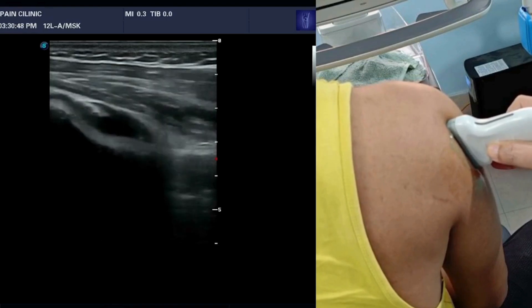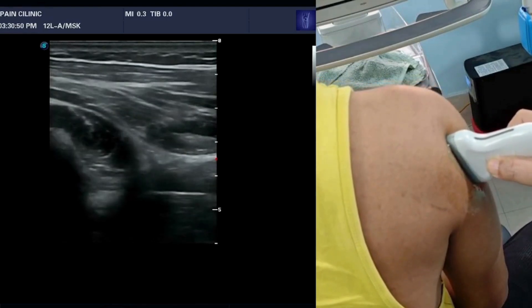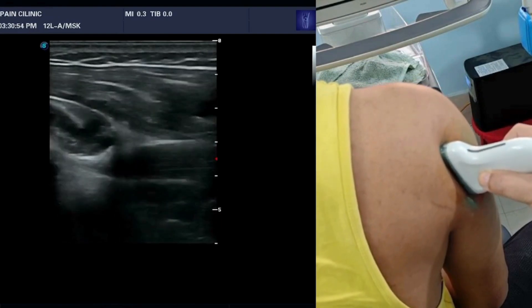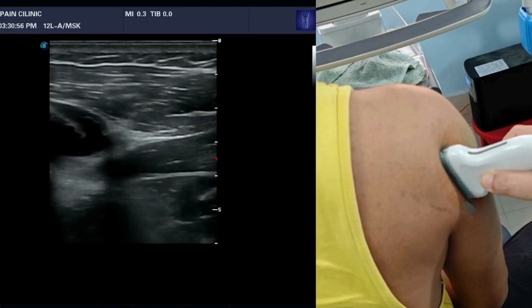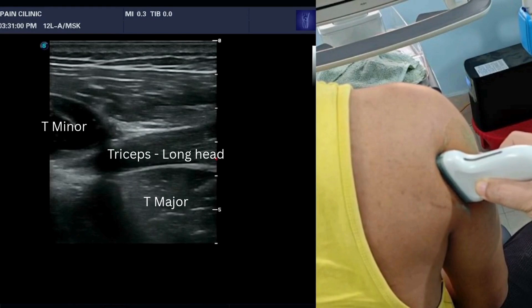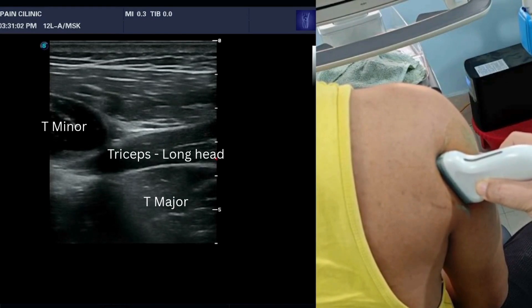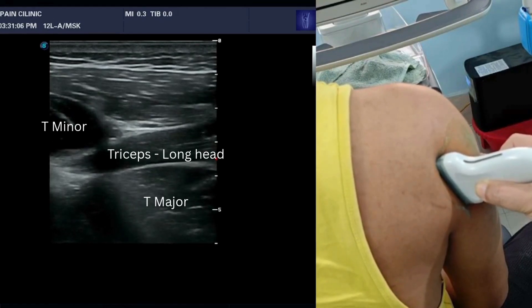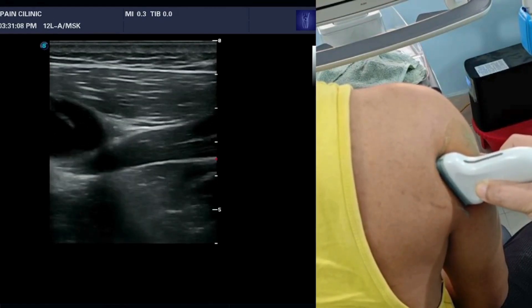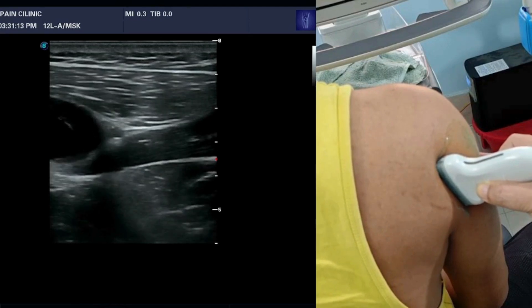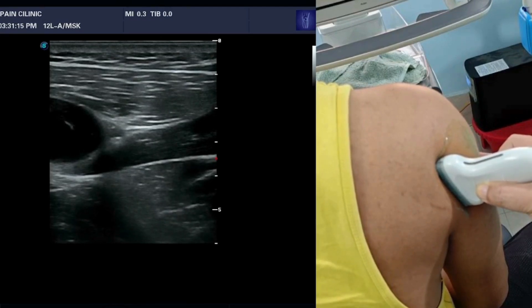Now moving medially to see the long axis of the long head of triceps. Here we can see two muscles in short axis — one is teres minor, which we have already seen in the earlier view, and the other is teres major, also visible in short axis — alongside the long axis view of the long head of triceps.